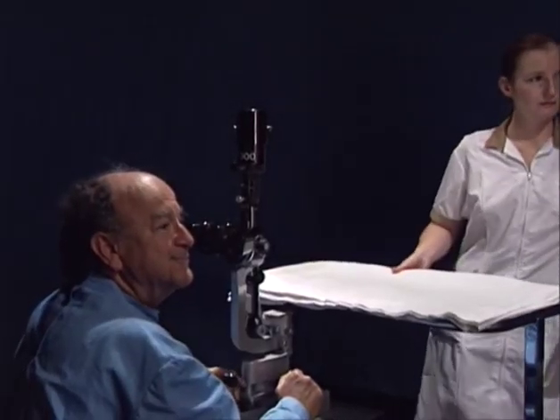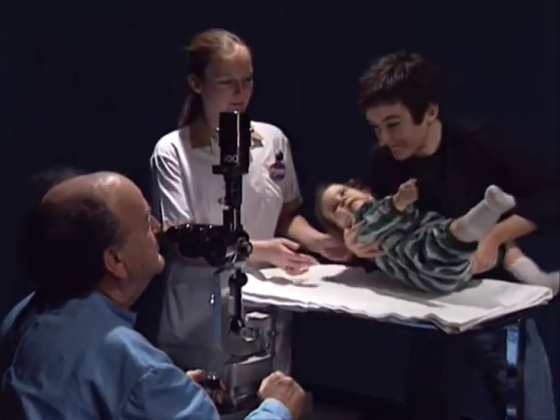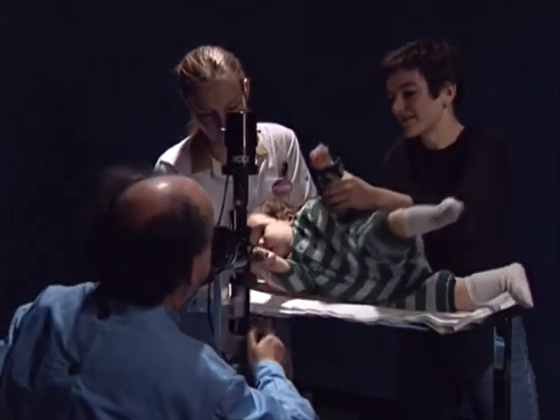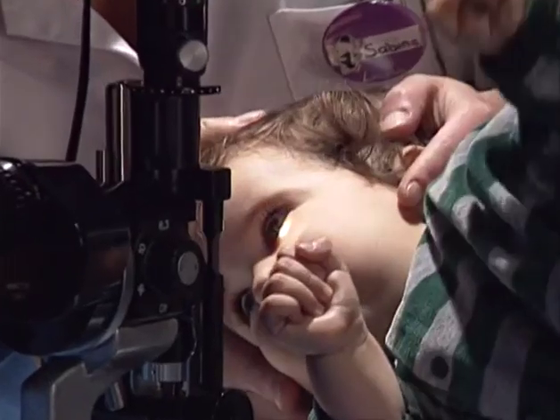A mobile tray is brought to the slit lamp, and the baby is gently laid down in a lateral position. Look how nicely the examination now can proceed. And isn't the baby sweet?